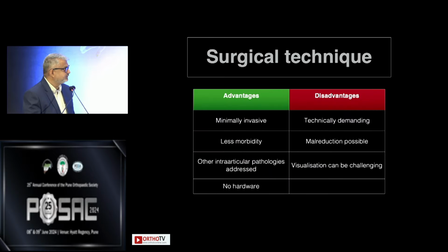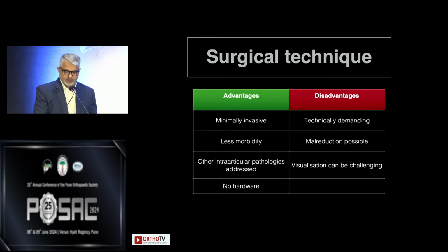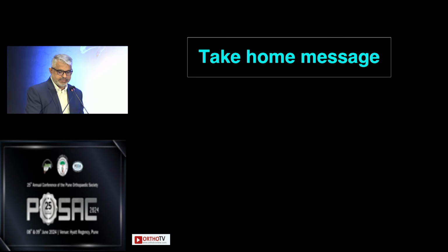What are the advantages? It's minimally invasive, less morbid, other pathologies can be addressed, and the most important thing as an arthroscopy surgeon for me is that there is no hardware. You don't require a revision surgery. God forbid this patient requires something in the future, can be taken care of. Disadvantages? Yes, everything has a learning curve, so that's something you need to be aware about. Mal reduction can be possible and visualization can be challenging.